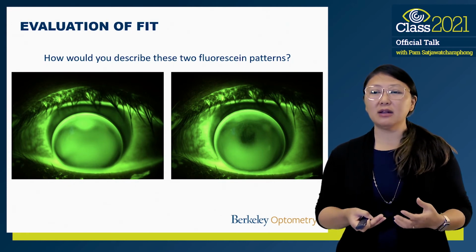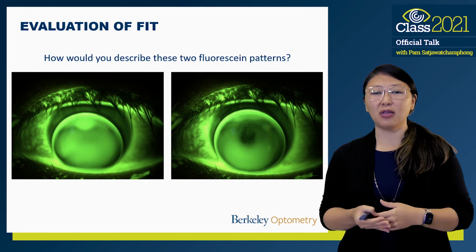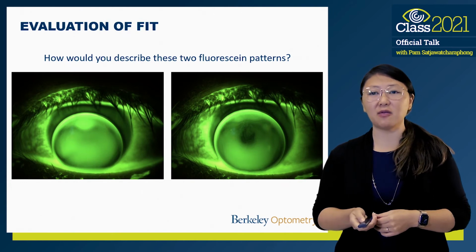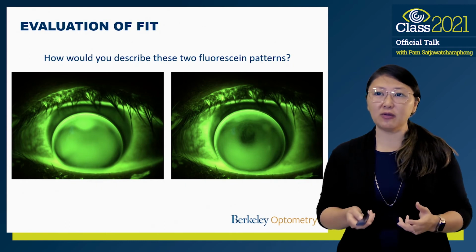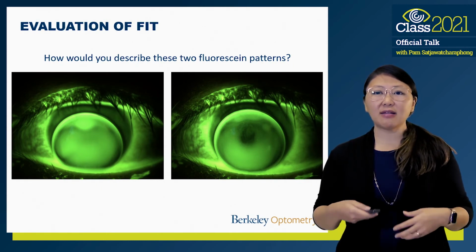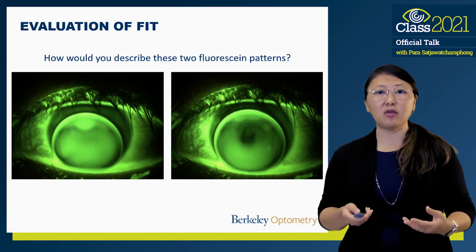If we waited a moment, then it actually looked like the image on the right, where you can actually see this is a bit of a flat fit. So I always recommend waiting a moment after you put fluorescein in and letting some of that superficial dye dissipate before you make your assessment.